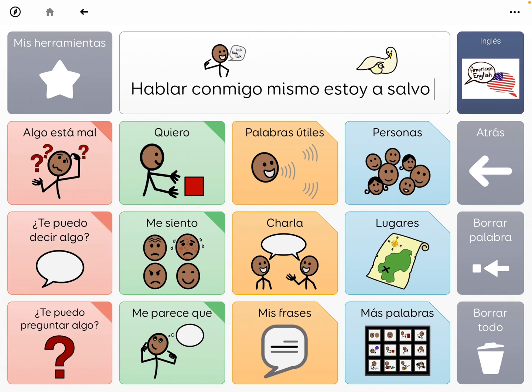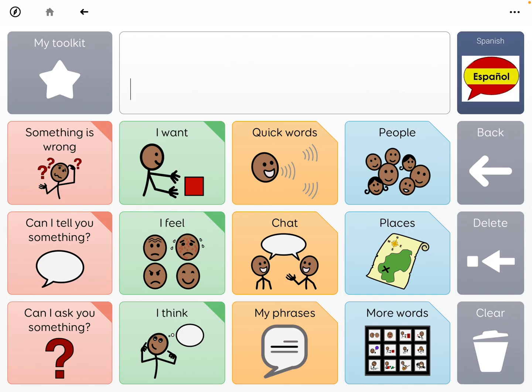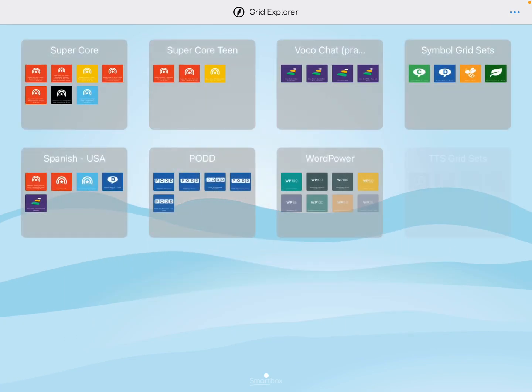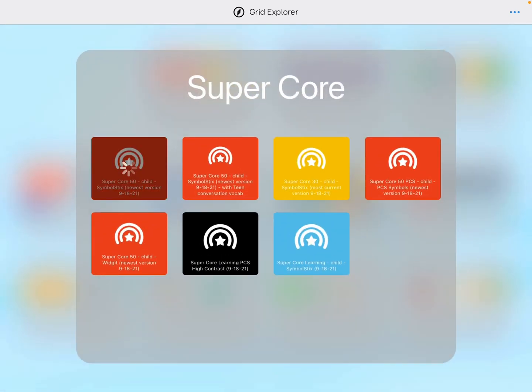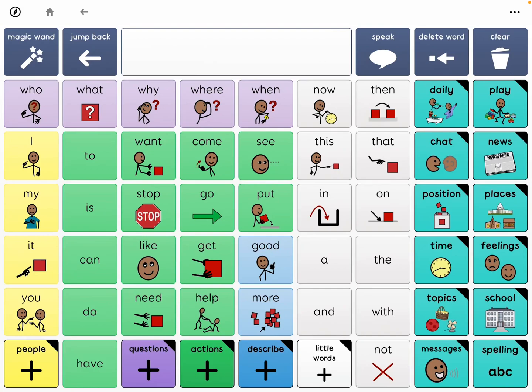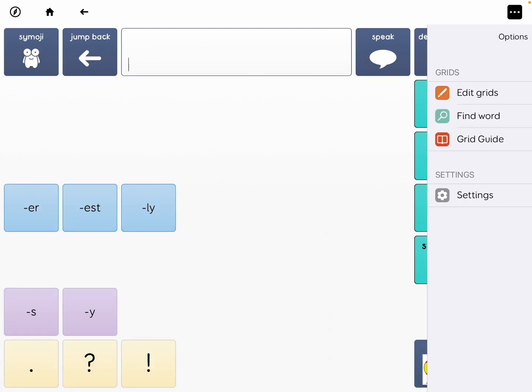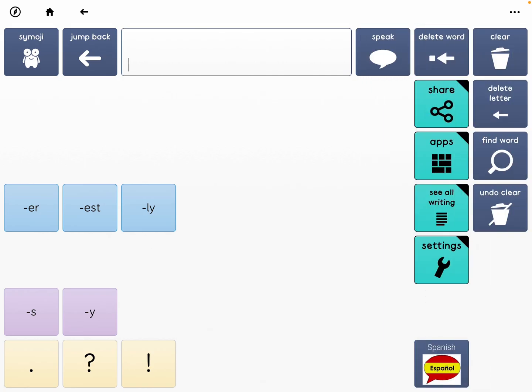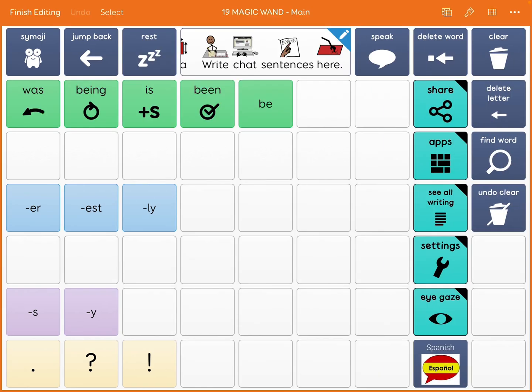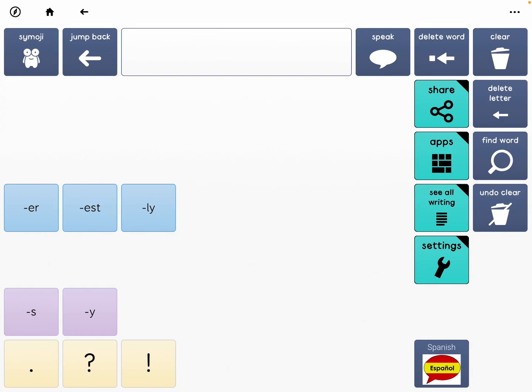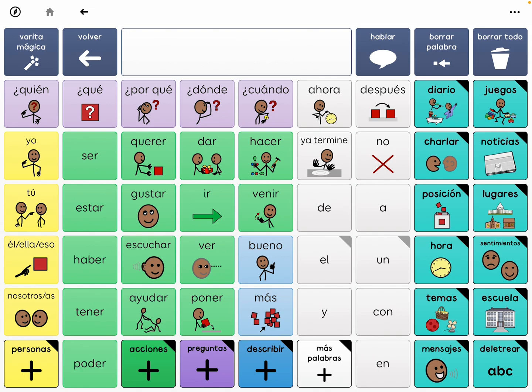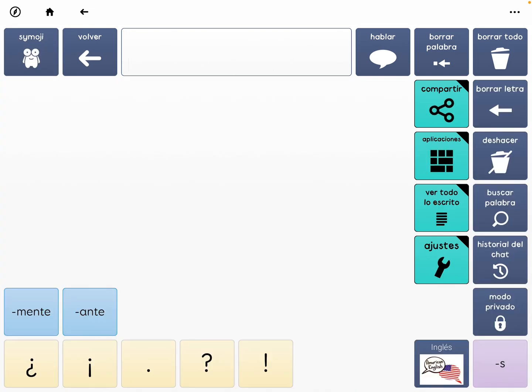The main point is having a quick way to toggle back and forth between different languages. I've also done this over in SuperCore. In SuperCore you don't have any extra real estate up by your message window, so I've gone under Magic Wand and added it there. Same concept — I took the button where you'd normally have an eye gaze rest button. So there's Spanish, and then in the same spot, English.